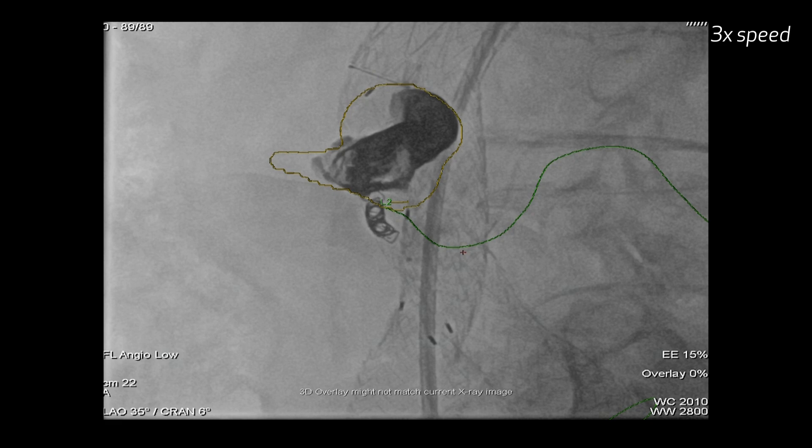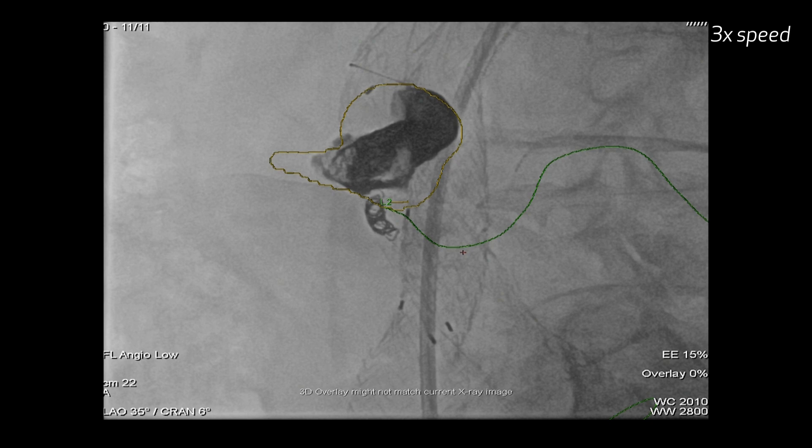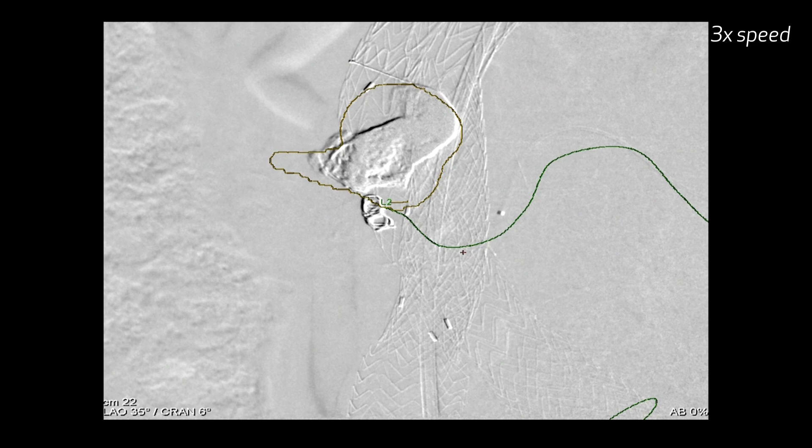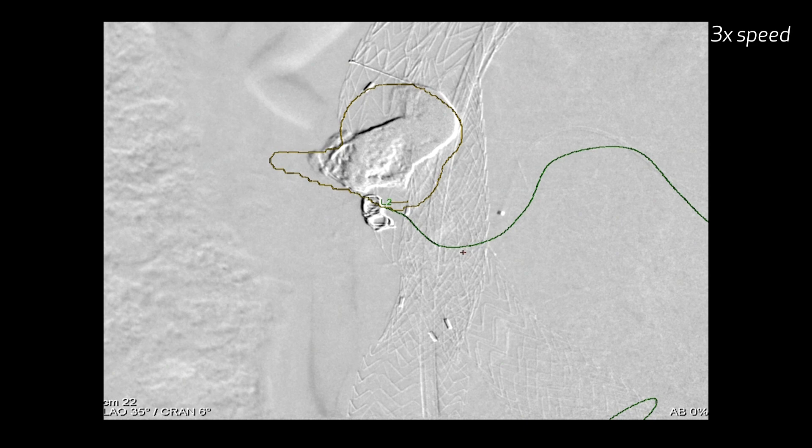One last coil — nicely packed, hopefully not covering the branches. Once we've done that, shoot some dye in there. At that point we're finished. We don't want to see any flow going back into the aneurysm cavity. You can take a small syringe with 25% contrast — you see the branches are still there, it's not flowing back, and we're happy with that. We terminate the procedure. This really shows how we can use a preoperative CTA, in this case a dynamic CTA, to map out the entire procedure. Thank you.